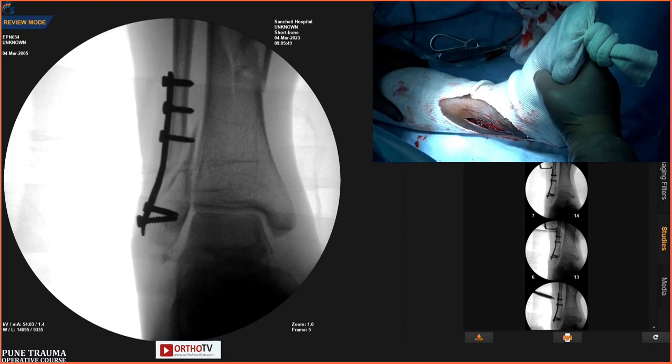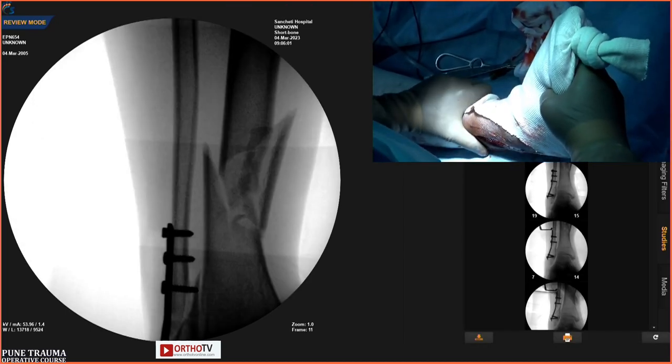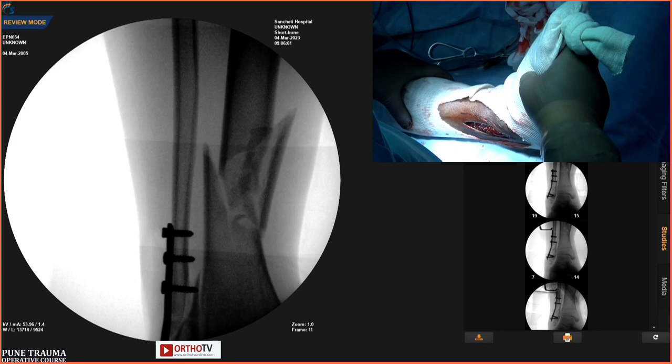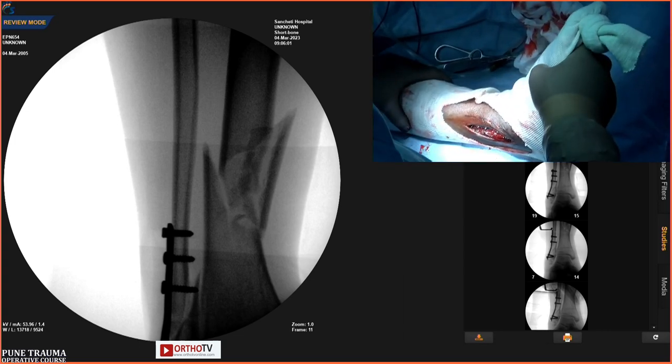You use the same implant, 3.5, or nowadays lots of 2.7, 2.4 pre-contoured plates are available. I use a dedicated fibula plate today. No, this is a dedicated fibula plate only, but this is a 3.5 system, the older version.